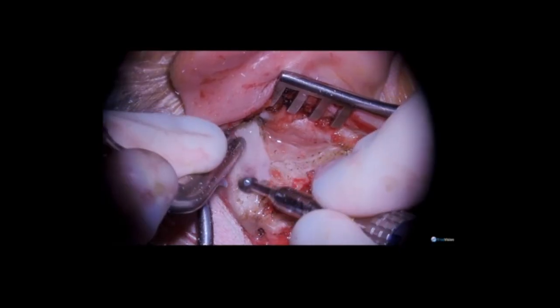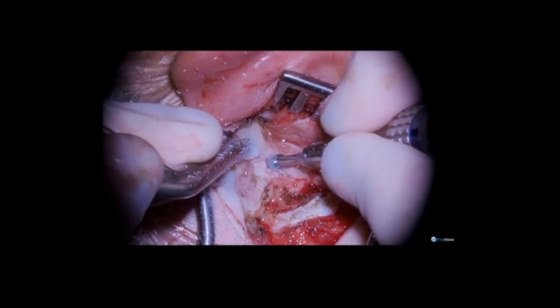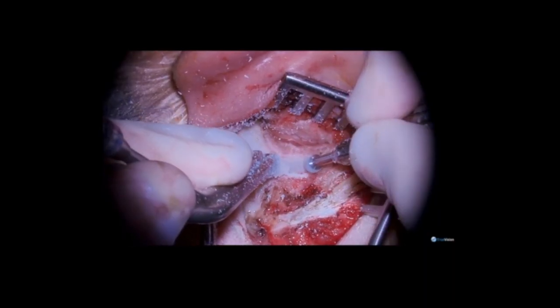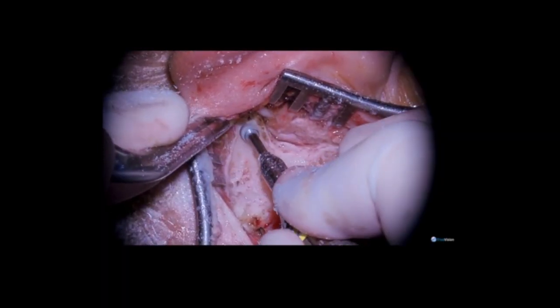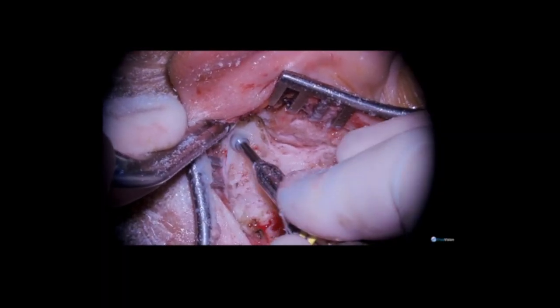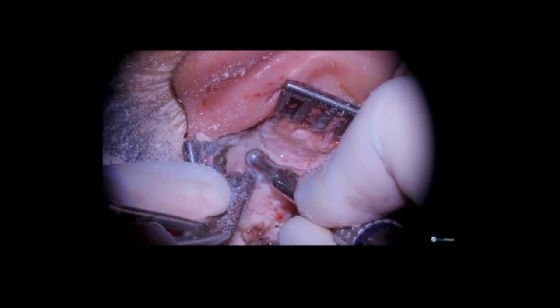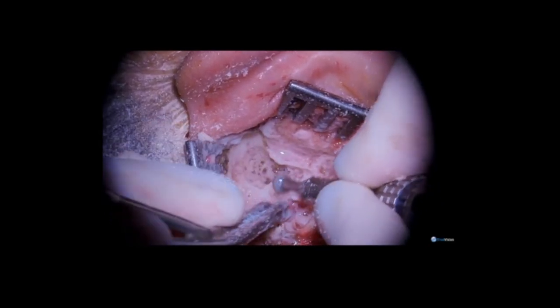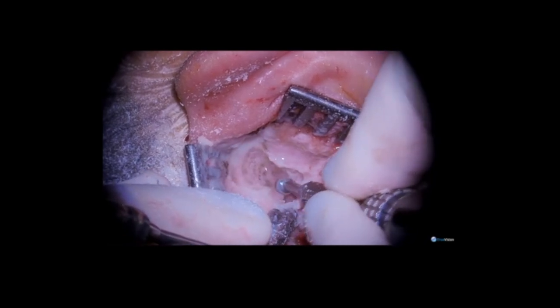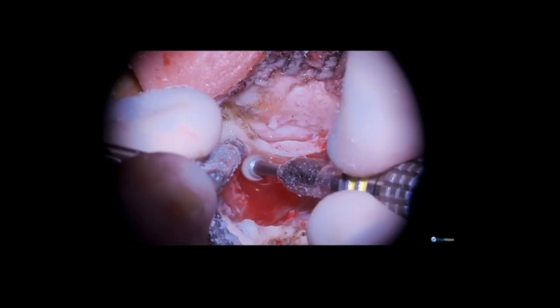I begin very anteriorly and superiorly to identify the position of the temporal dura, keeping the bone intact, and then work inferiorly towards the tip to identify the position of the external auditory canal. We will go through Kerner's septum, taking great care and attention to follow the position of the tegmen and the temporal dura, keeping the bone intact, as well as identifying the position of the sigmoid sinus.